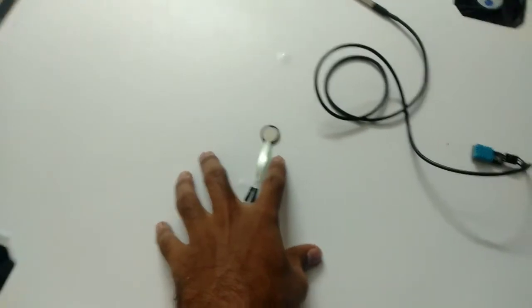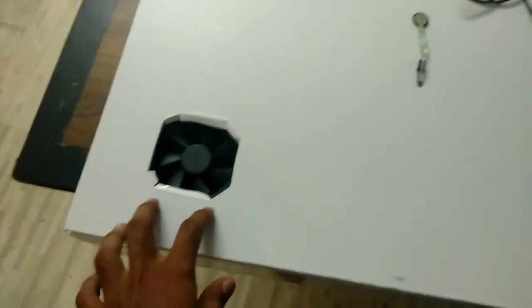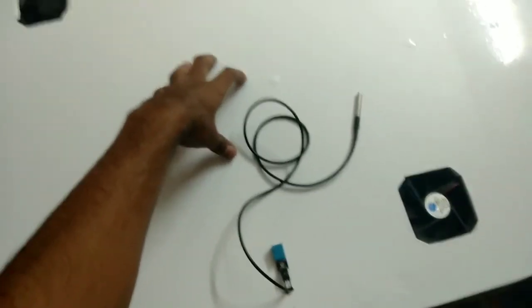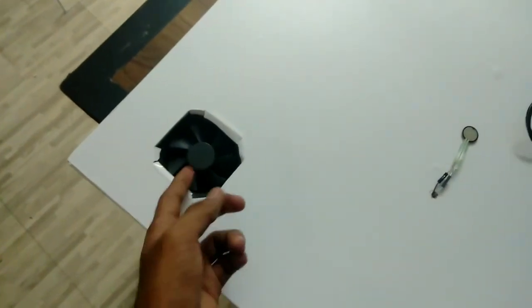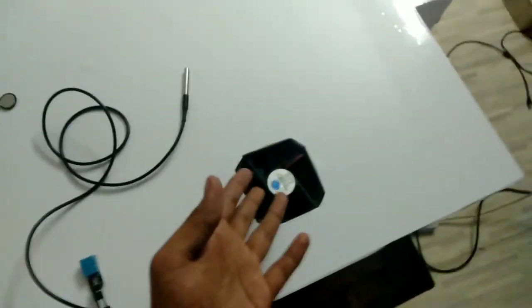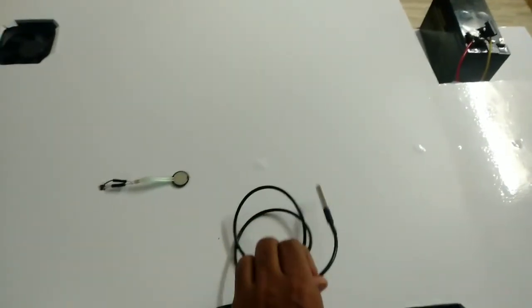This is the force sensitive resistor. As you can see, the system is not on because nothing is placed on the force sensitive resistor. When something is placed on that, for example the infant, then the fans and the heating system will be activated. There's a fan at the center of the incubator with the heating element in front of it. Basically this is an exhaust fan. When the heating system is on and this rotates, it pushes the air inside, the fan in between pushes the air this side, and this fan brings the heated air outside the box. So there's a circulation over here, and this sensor is used for the body temperature.